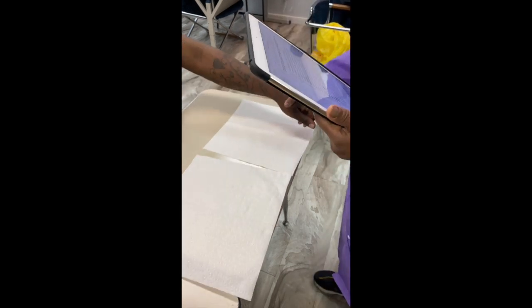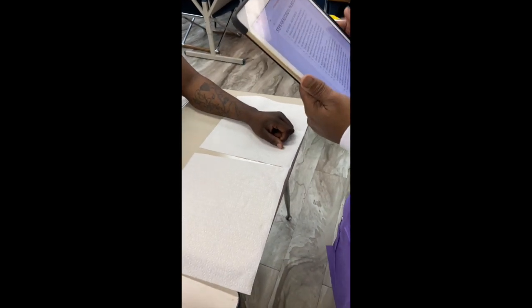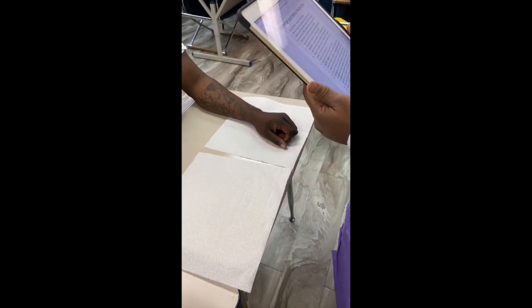Now I just want to check your wristband. Good, that checks out. Now I'm going to put my paperwork down, and I'm going to gather my supplies and sanitize my hands.